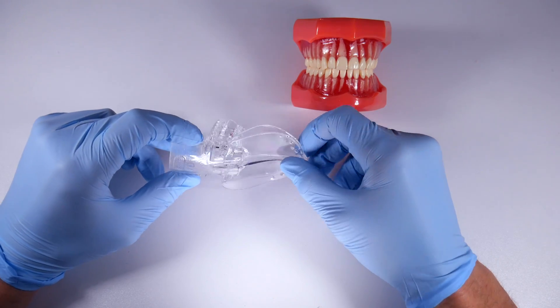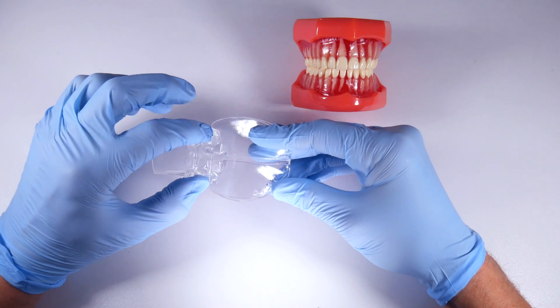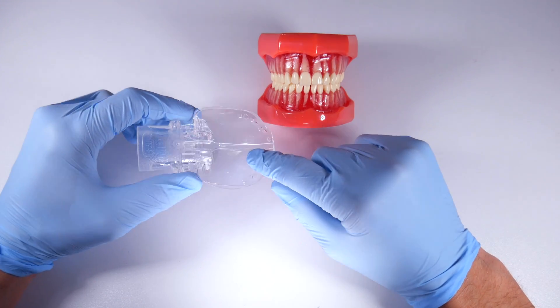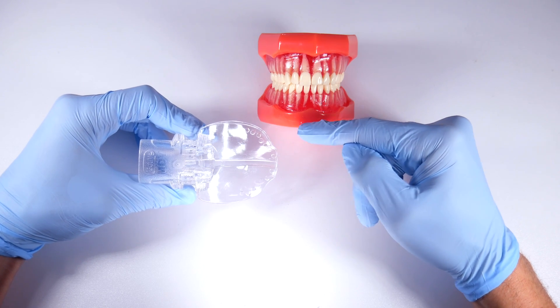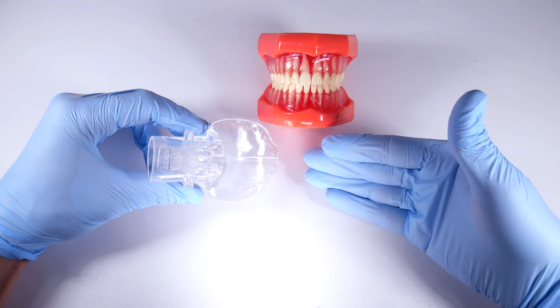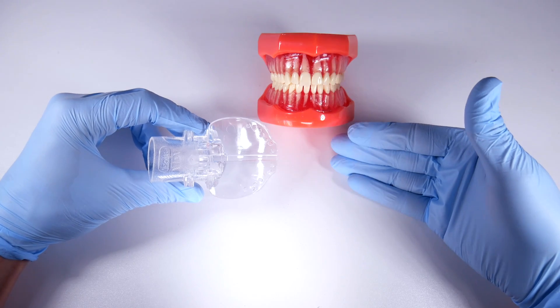It's great for isolation, it helps with suction — that's what these little holes are for — and it gives the patient a bite block to rest their teeth on. For lower third molars, this has really changed the game. What I do is cut it off right here at this little isthmus and take off that buccal segment, which allows freer mobility of the buccal portion so the cheek can stretch out more.